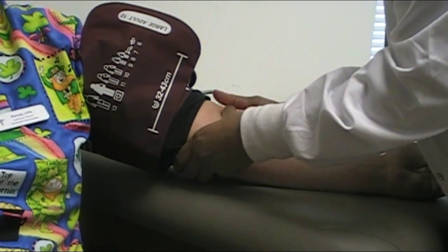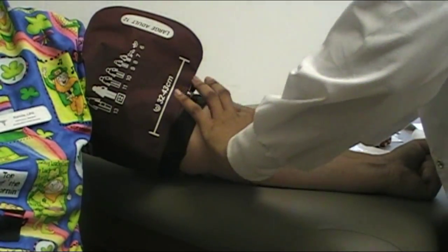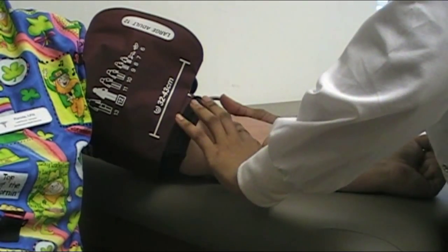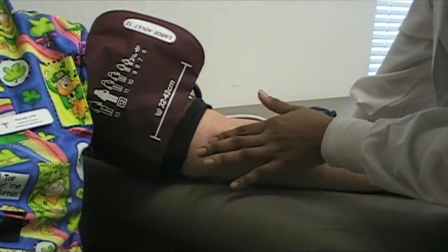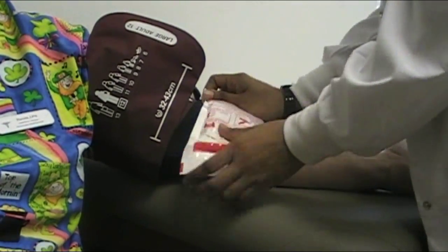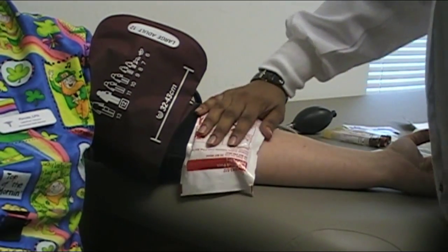When you feel for these, you probably shouldn't use your thumb — use one or two fingers, your index finger. Make a fist. The goal with making a fist is we want to make sure they're just opening and closing their hand, not tensing up all the muscles in their arm. If they tense their arm muscles, especially drawing potassium, they'll raise the potassium level. So you lower the limb, open, close, open, close. If you don't find anything right away, put that hot pack back on and let it sit. There are a couple of main places to look: right in the center and right on either side, medial or lateral.